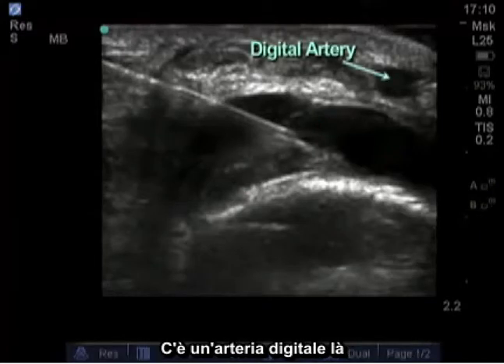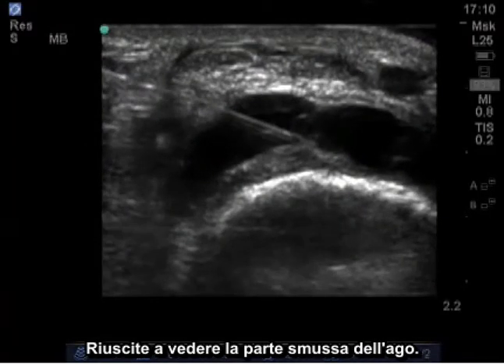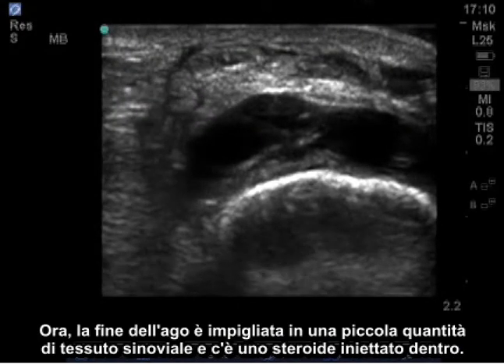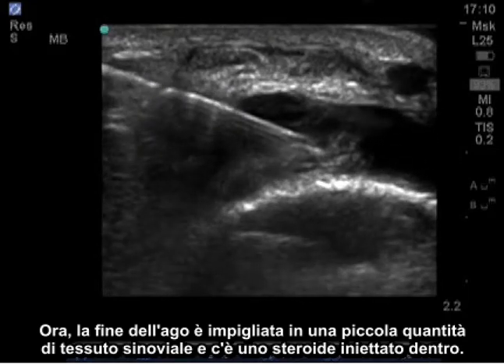There's a digital artery over here, and the needle can be seen coming down from the left side of the screen. You can see the bevel on the needle. The end of the needle is caught in a small amount of synovial tissue, and steroid is injected in.